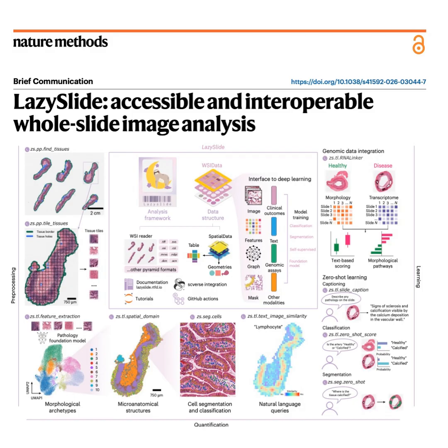But when they used MoFA to fuse the visual morphology with the RNA, the healthy and sick patient groups separated beautifully on the UMAP projection. The morphology, the physical shape and disruption of the tissue, contained crucial biological context that the sequencing alone simply could not see. So the physical architecture of the cell and its transcriptomic output are fundamentally linked. By bringing them together, LazySlide uncovers disease mechanisms that are totally invisible if you only look at one modality.